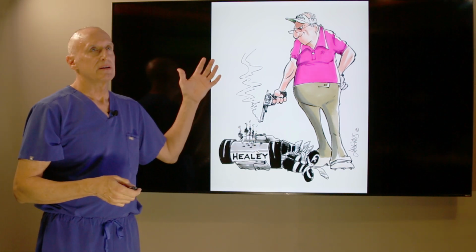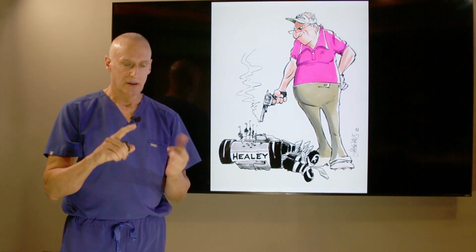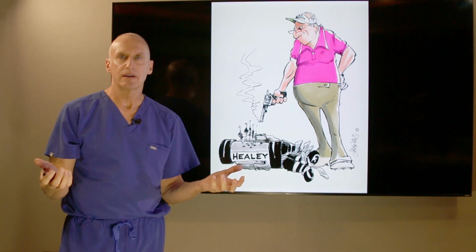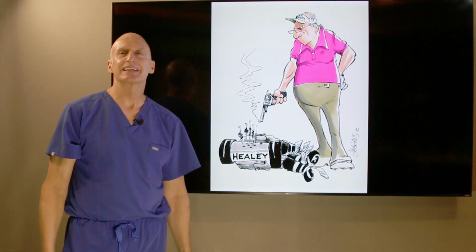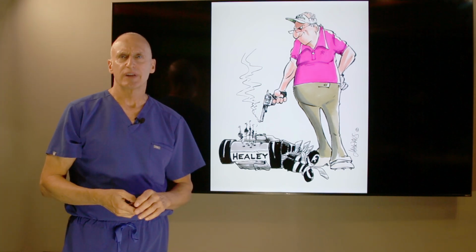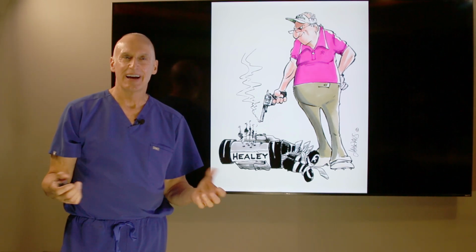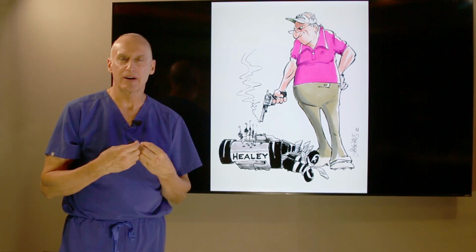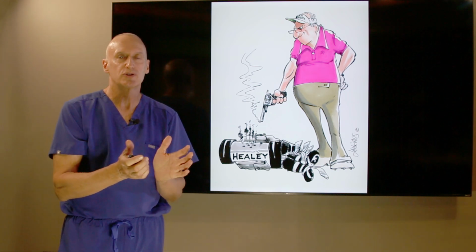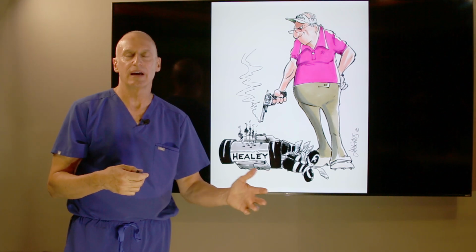But anyway, so many times I hear from lab technicians, other implant doctors, that FP1 is just too hard. And they're right. It is. It's really hard. I even had a technician say to me one time, the problem with FP1 is you've got to worry about those damn papilla. And I'm like, yeah. That's what we all should be worried about, is that preservation of healthy gums and bone should be our first concern in implant dentistry, not something that gets in our way.